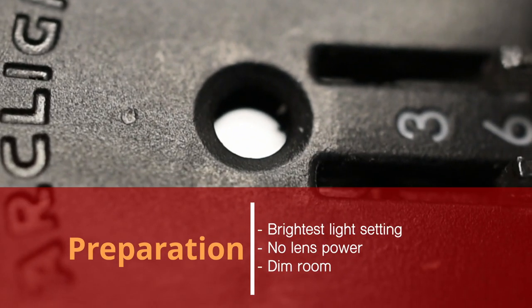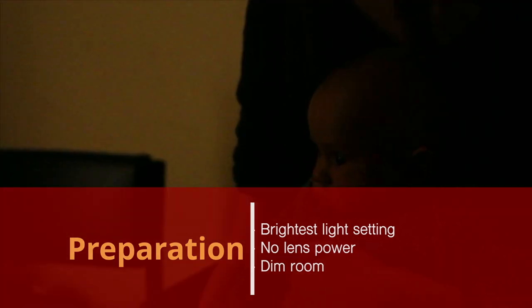Make sure the lens rack is at the top where there is no lens power in the sight hole. The examination room needs to be quiet and dim. Most babies will then naturally look at a light.